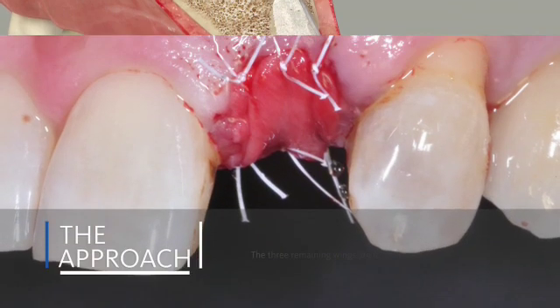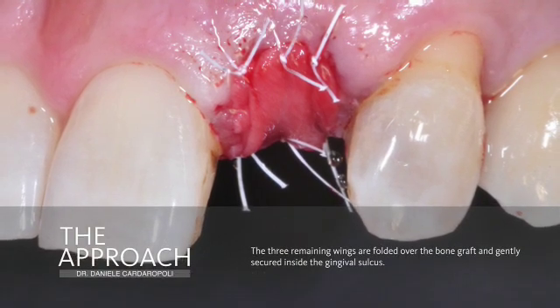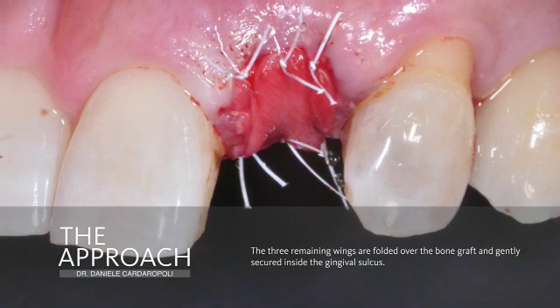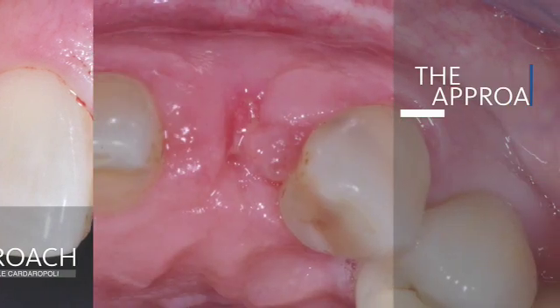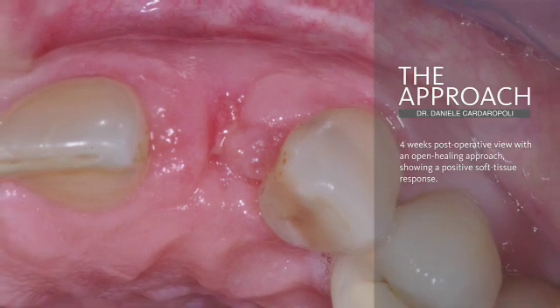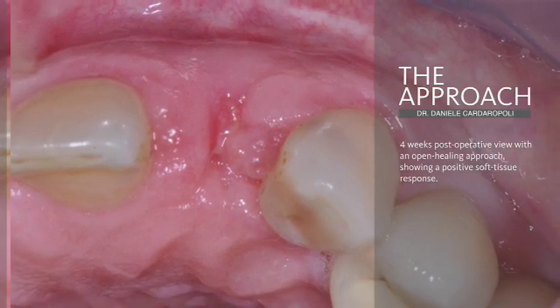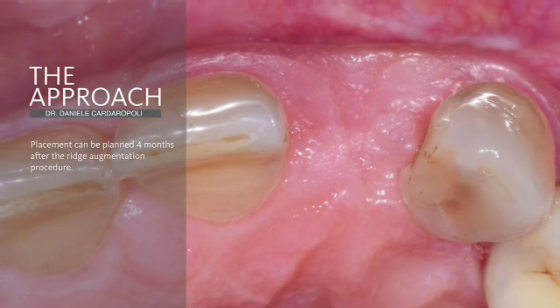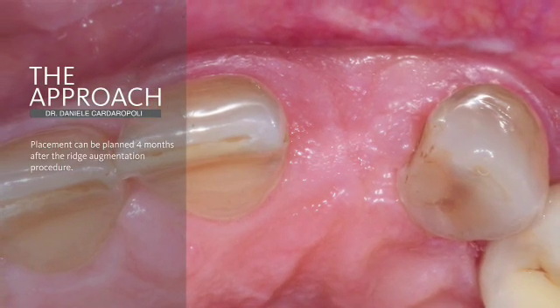The three remaining wings of the membrane are then folded in order to cover the biomaterial, and the membrane is sutured with a single interrupted suture to the surrounding tissues. With this open healing approach, we achieve an increase in the width of the keratinized tissue and, at the same time, a coronalization of the free gingival margin.